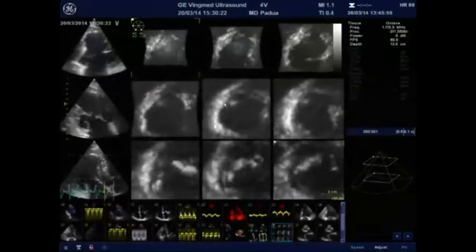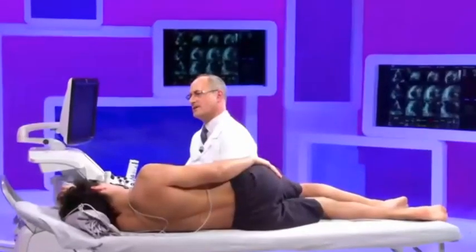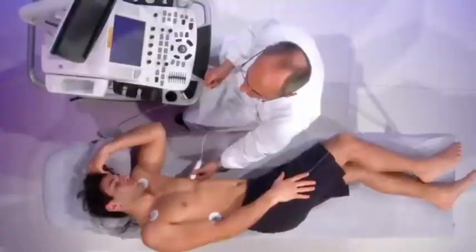However good your examination has been, however careful your measurements have been, I recommend again not to take what you have measured in this single examination as the detail to judge the overall function of this transplanted heart.